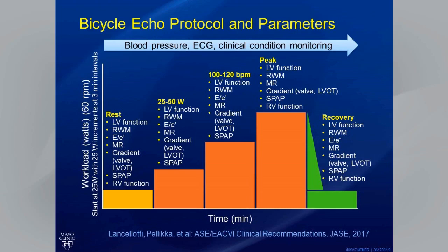Now, you can use longer stages, whatever your lab decides to use, but a standard protocol is a good idea to have so that you can make serial comparisons between patients and for the same patient. It's good to obtain your measurements at the different stages of exercise because an increase in systolic pulmonary artery pressure that occurs at a very low level of exercise certainly has a different connotation than one that occurs at a very high level of exercise. So the rate of change of these parameters is also important.